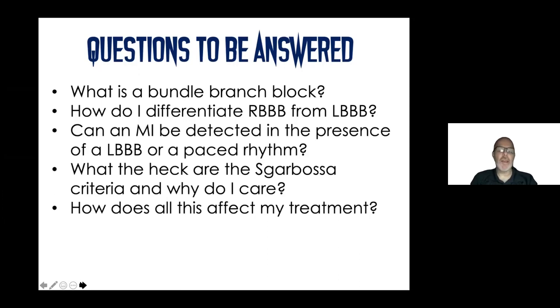So the machine is like, I'm not even gonna go there. That means it's up to us to have the clinical acumen as well as the EKG interpretation skills to be able to increase our index of suspicion as to whether or not we think that patient could be having an underlying MI. Now, I should preface this conversation by telling you that I am not insinuating that you start looking at bundle branch blocks in the field and start calling in code hearts or heart alerts or STEMI alerts just because the patient has a left bundle branch block.